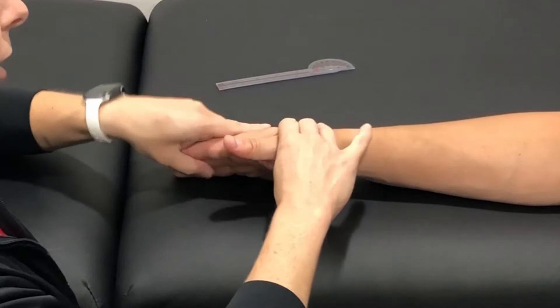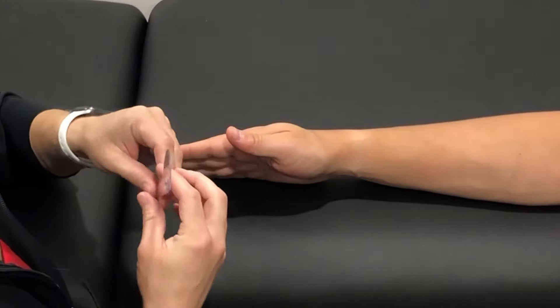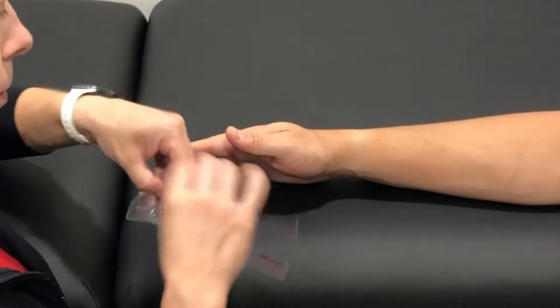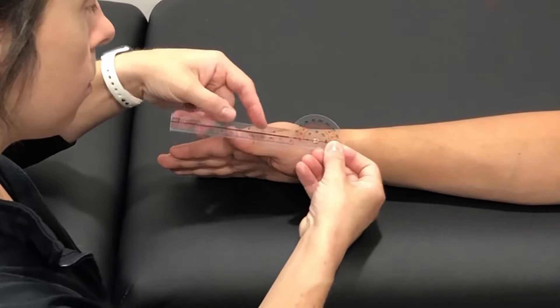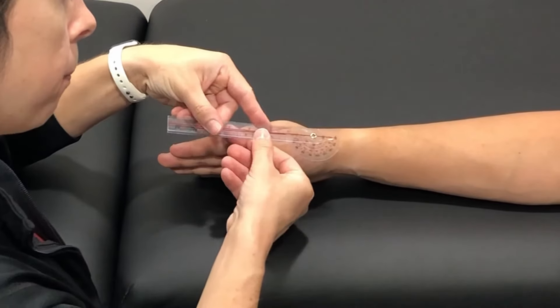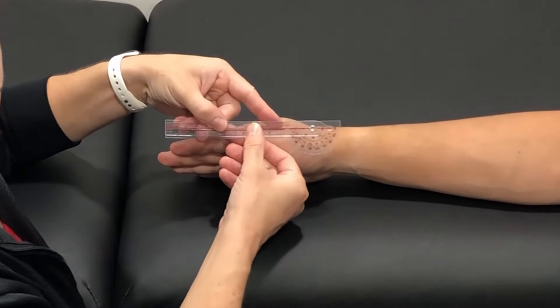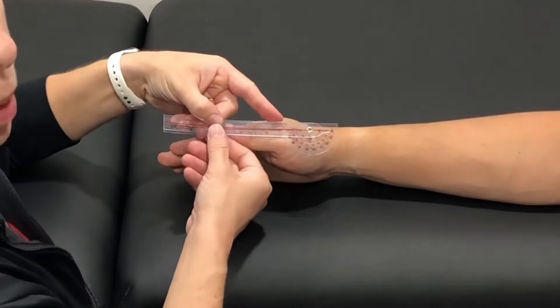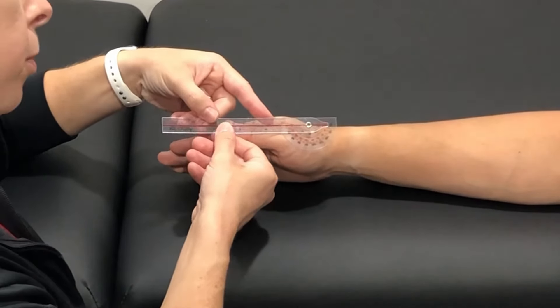Measuring active range of motion. I'm going to line my fulcrum up with the lateral aspect of the scaphoid or the radial styloid process. I'm going to line my stationary arm up with the lateral midline of the second metacarpal. Line my moving arm up with the dorsal midline of the first metacarpal.